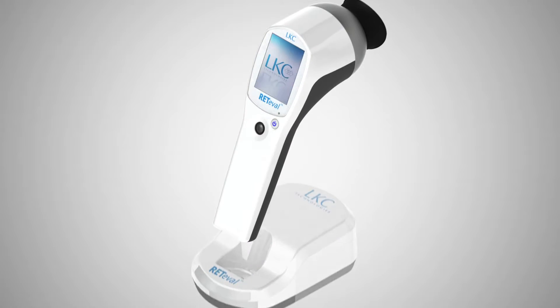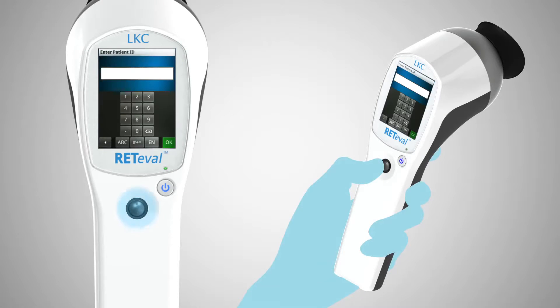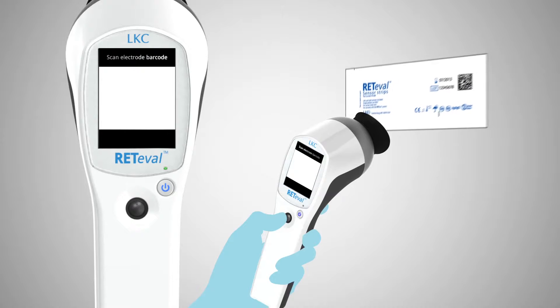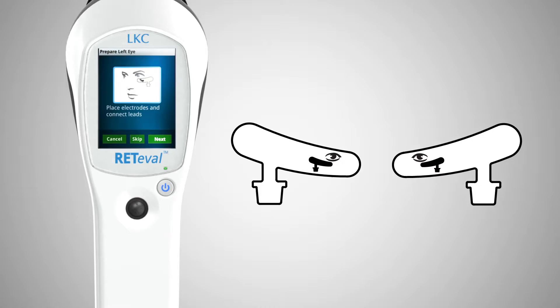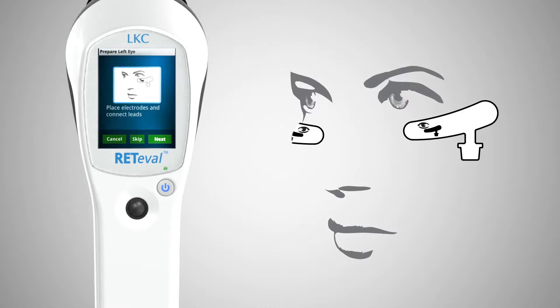First, remove the device from its charging cradle. Using the built-in user interface and joystick, enter the patient ID and birth date. Scan the barcode on the single-use sensor strips using the built-in scanner. The self-adhering sensor strips are designed for proper location and orientation. Place one below each eye. Using the simple clip connector, attach the Reteval device to one of the sensor strips as shown by the graphic on the device display.